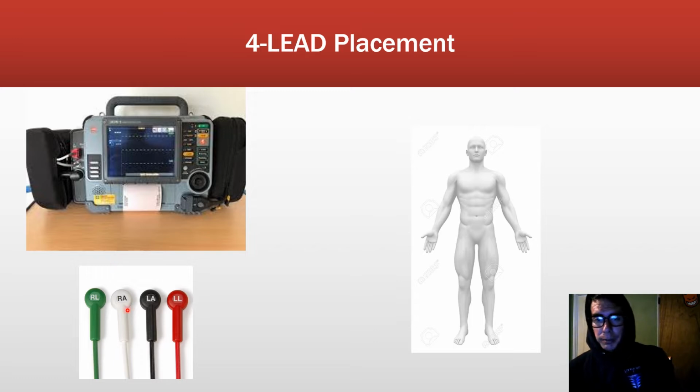One thing, just remember they're labeled because I forget. So there's a saying to remember which one goes where, and I have to say it in my head every time because I forget that it's right on the back of the thing, right here. I could just look at it and then I know, but for whatever reason I forget that, so every single time I have to say this saying in my head to remember.